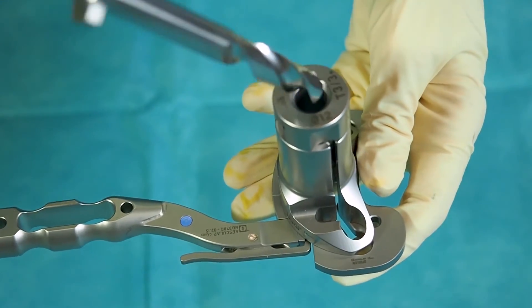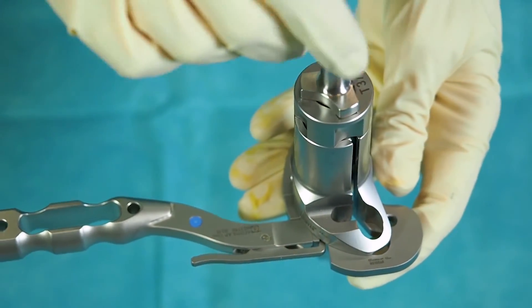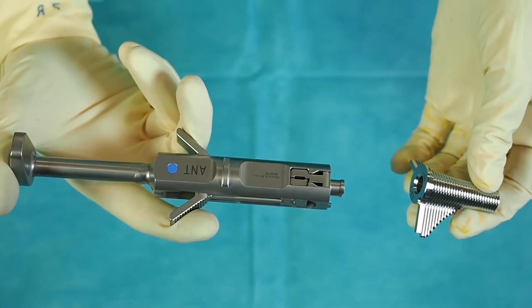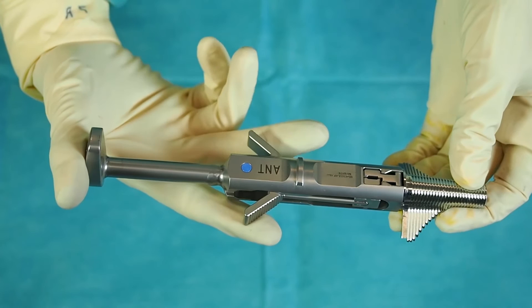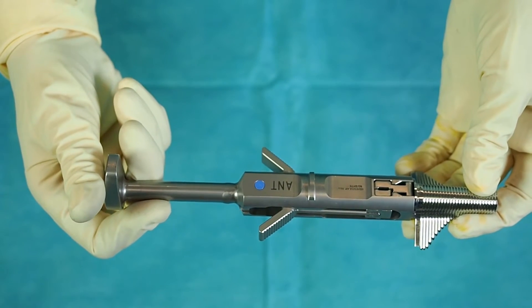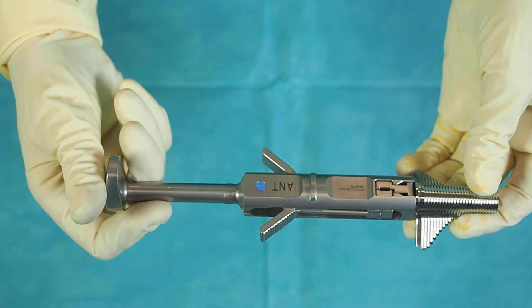The drill with stop is first used to prepare the bone for the winglet chisel. The wing stem preparation is performed by using the winglet chisel connected to its handle through the guiding tower down to the stop. For every tibia size, there is an own winglet chisel as the tibia wing stem of the final implant is growing by size.